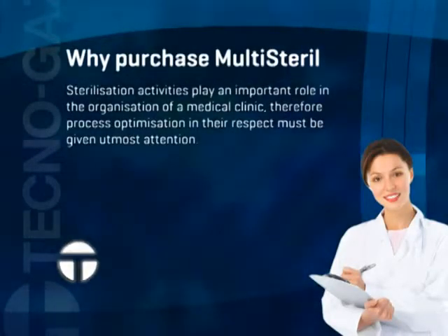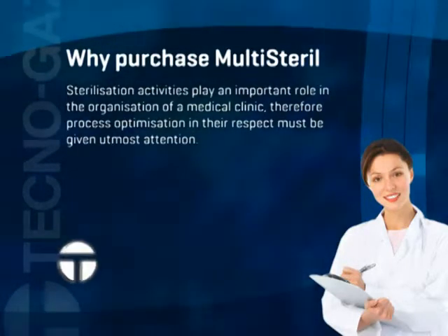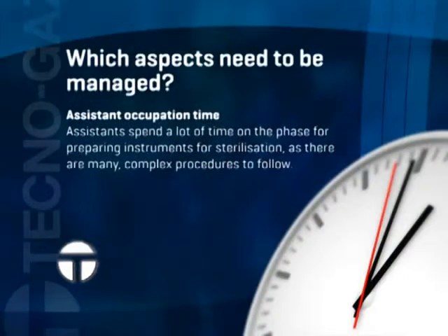Why purchase Multisteril? Sterilization activities play an important role in the organization of a medical clinic. Therefore, process optimization in their respect must be given utmost attention. Which aspects need to be managed?